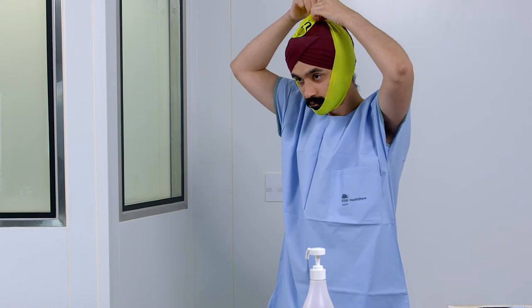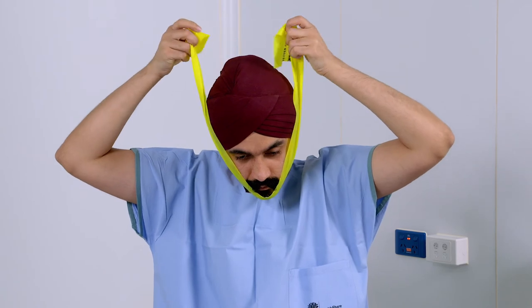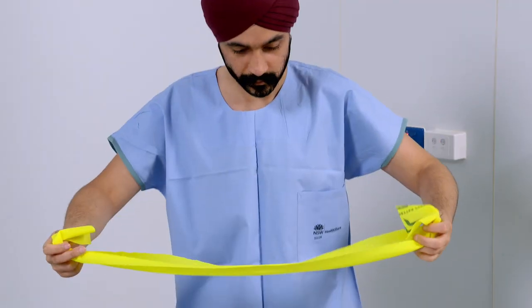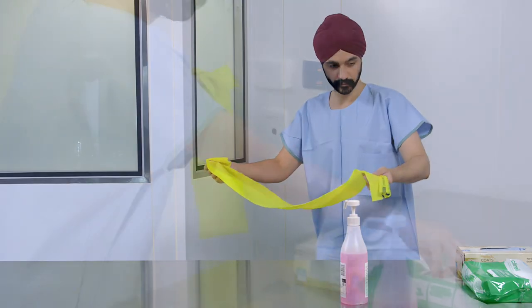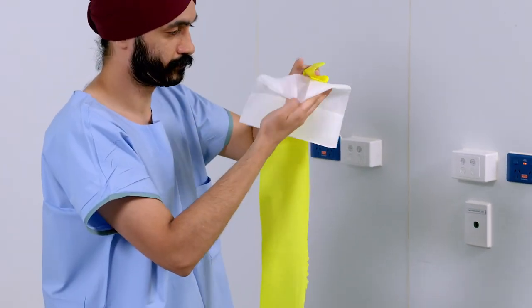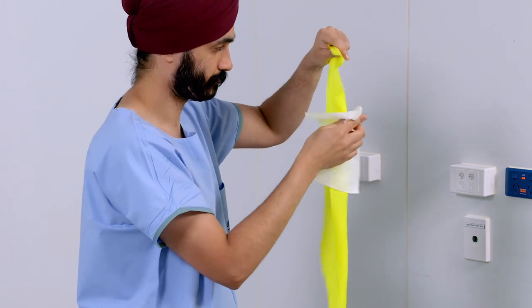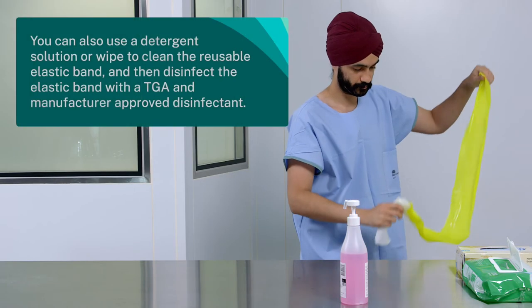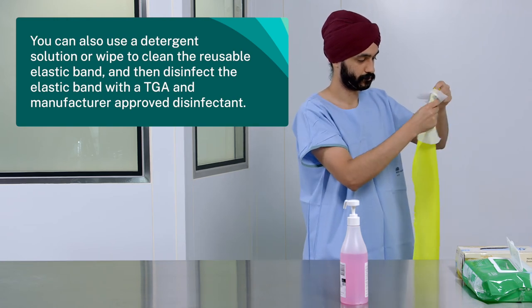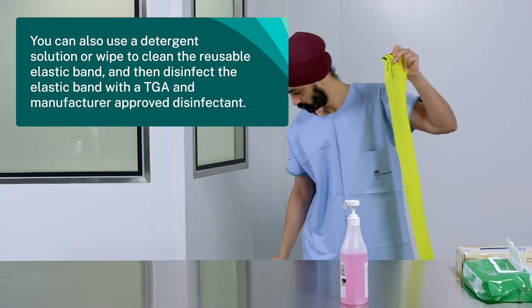Now untie the elastic band. Clean and disinfect the elastic band using a dual purpose, Therapeutic Goods Administration approved cleaning and disinfecting agent. You can also use a detergent solution or wipe to clean the reusable elastic band and then disinfect the elastic band with a manufacturer approved disinfectant.